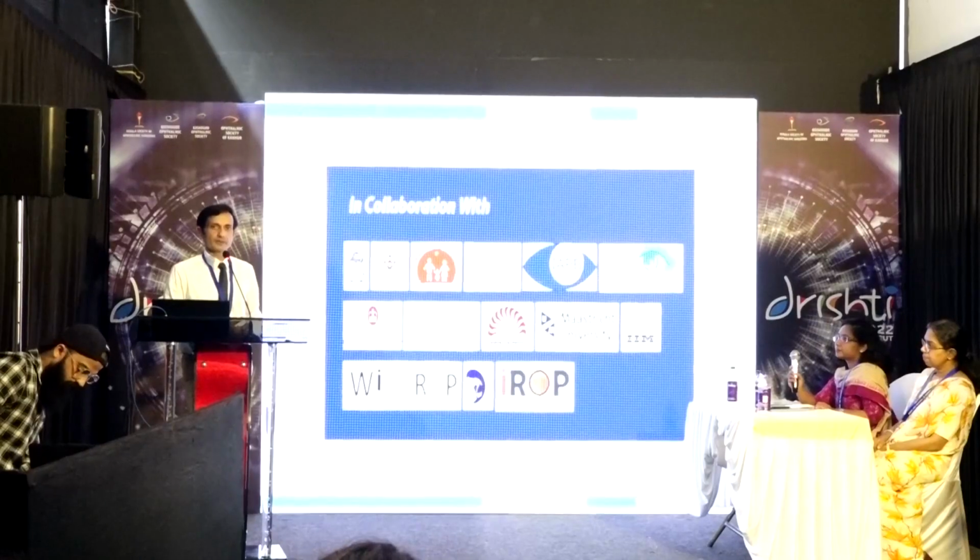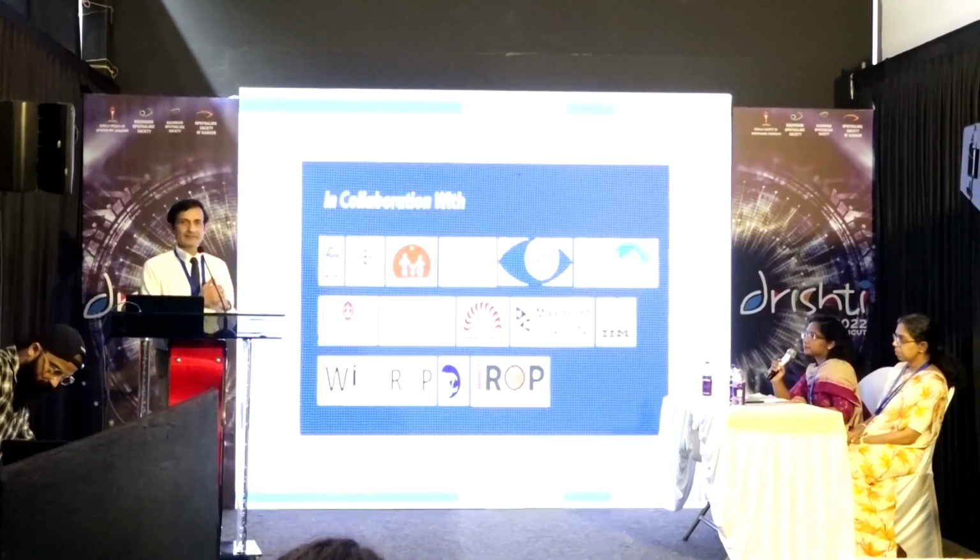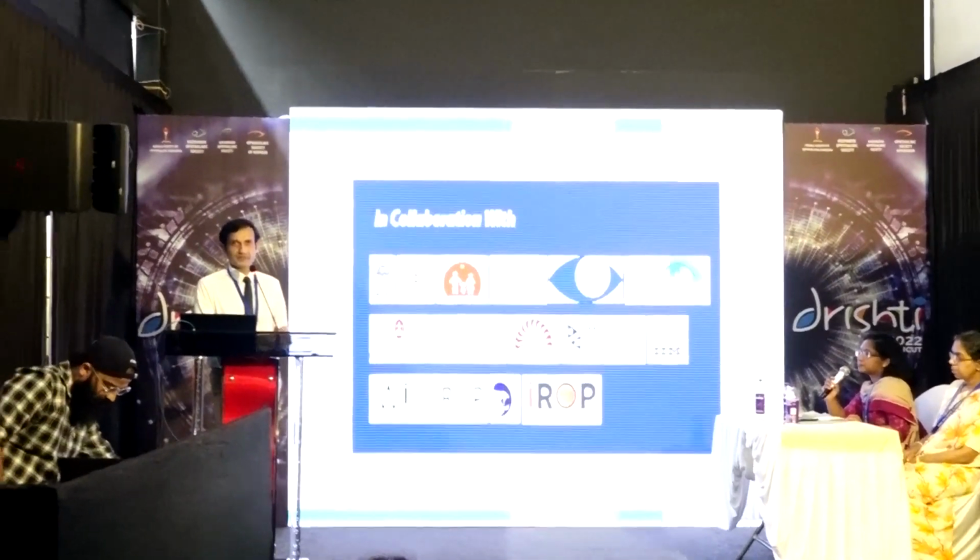You don't need to do it on GA, but it is done in the OT with the anesthetist standing by. So an IV access is obviously important because we are giving an IV fluorescein. Some of my friends have tried the oral fluorescein, not very useful in aggressive ROP. By the time it comes into the circulation, it's very poor. So exactly the same precautions that you would take for laser, you would take for angio.